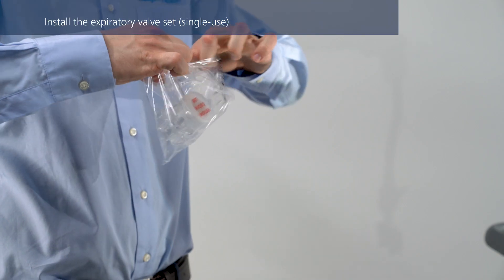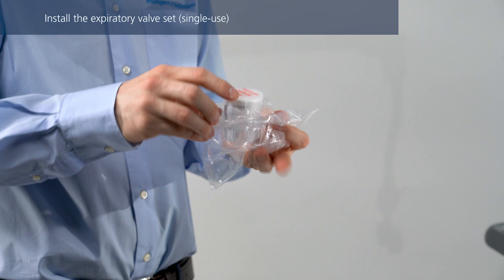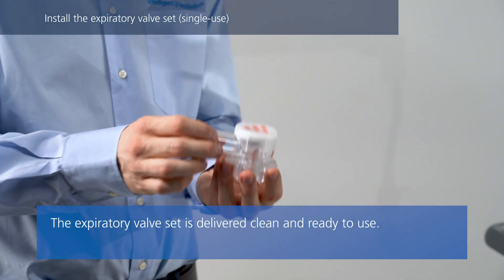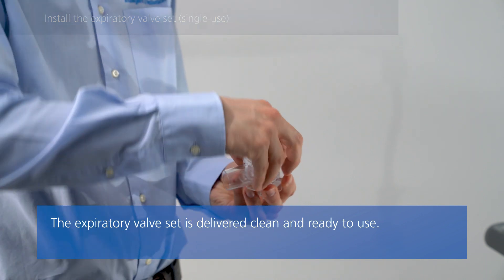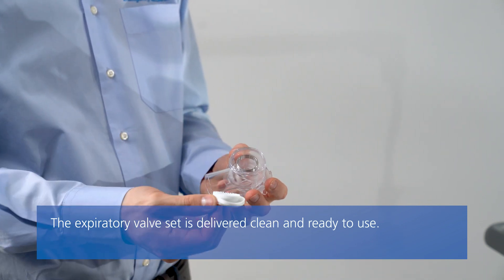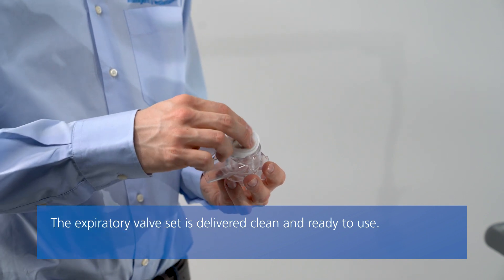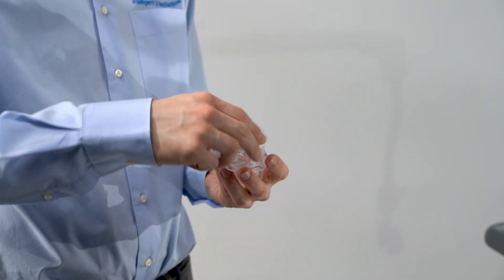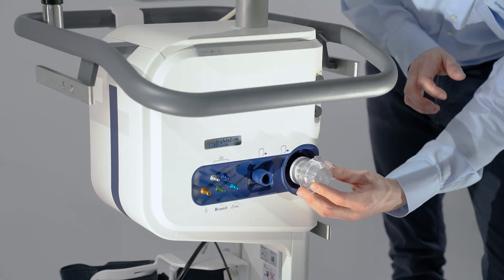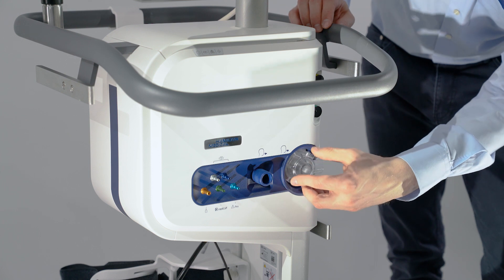If you are using a single-use expiratory valve set, first remove the safety cover. Ensure that the membrane is properly aligned with the expiratory valve housing and the metal plate is visible and facing upwards. Position the valve in the expiratory port, ensuring it is straight, and twist it clockwise until it locks into place.